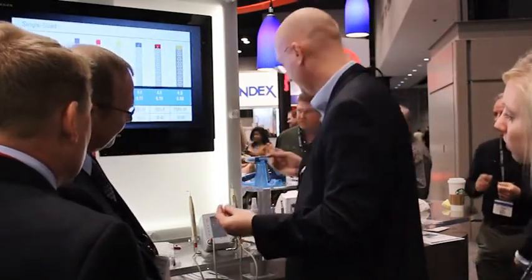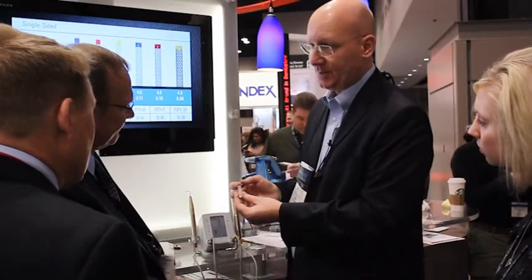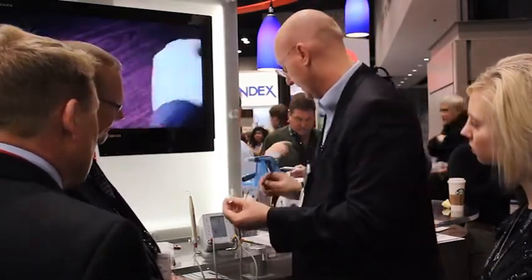We take a hand plugger and just tamp it down so we can feel that our apex is sealed. At this point, if you want to put a post in, you take your post drill, drill it, cement it in place, and you're ready to go.